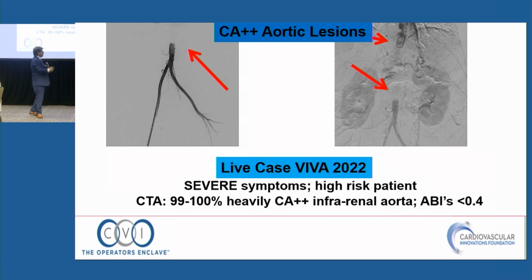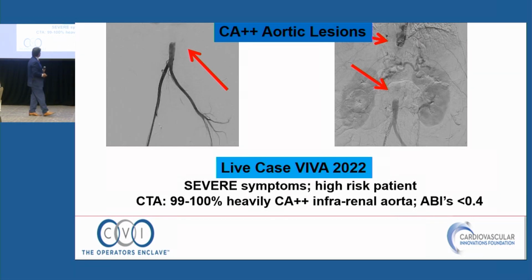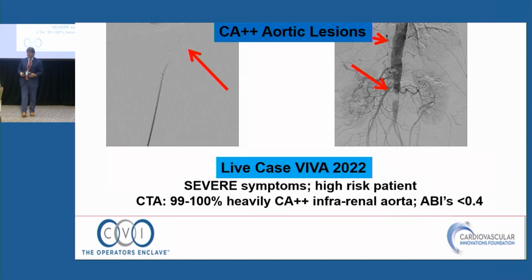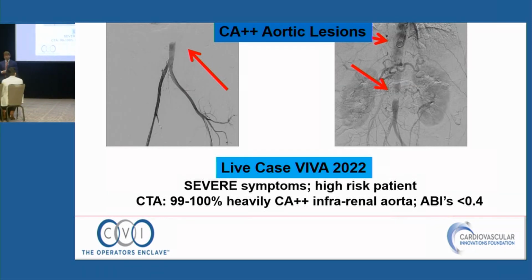So let me just stop. Should we even do this? I'll let you guys lead the interaction, and then we'll zip through this and get to the next one if we can. Dr. Eidt, what are your thoughts regarding this lesion and how you would want to approach this?